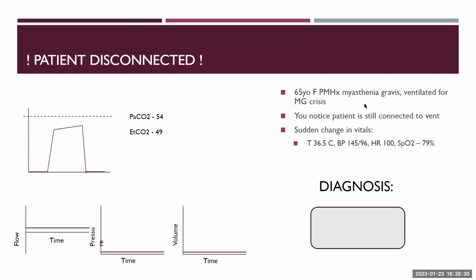With this one, a 65-year-old female with a past medical history of MG, ventilated for a crisis. You notice she's still connected to the vent, but there's a sudden change in the vitals. So who wants to walk through what the vent is changing or showing?